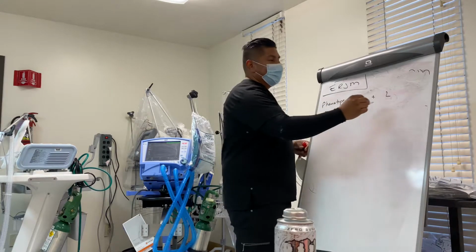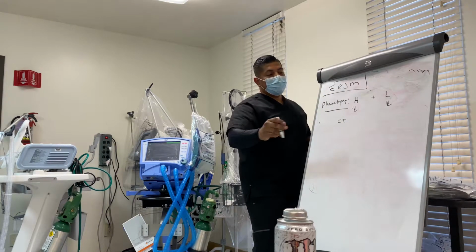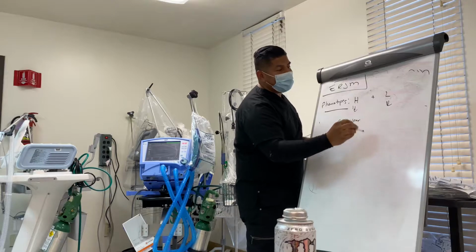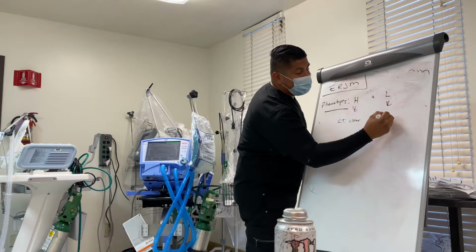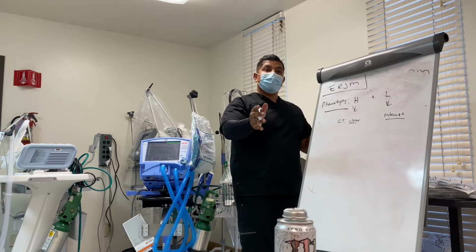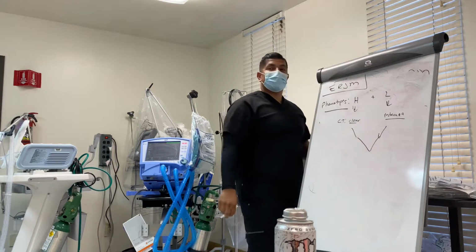Good? Good. So, phenotype H patients, when they were brought in to the ER, we did a CT scan on all patients. Phenotype H patients had a clear CT. Phenotype L had your classic interstitial pneumonia showing. Both needed oxygen. We intubated both. The problem is that one did not need such aggressive therapy.